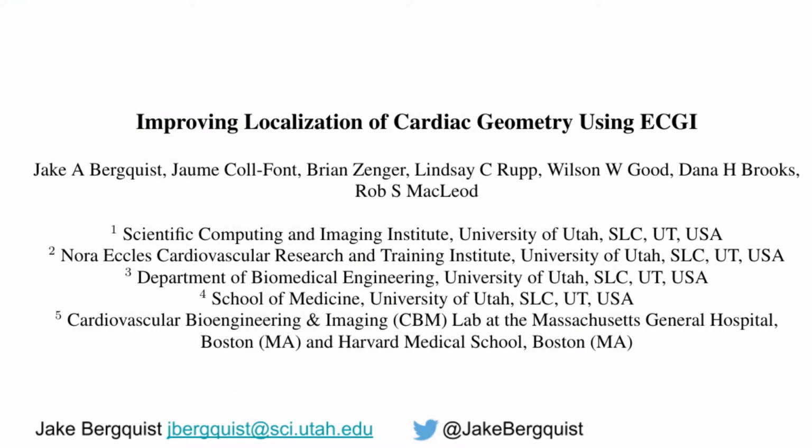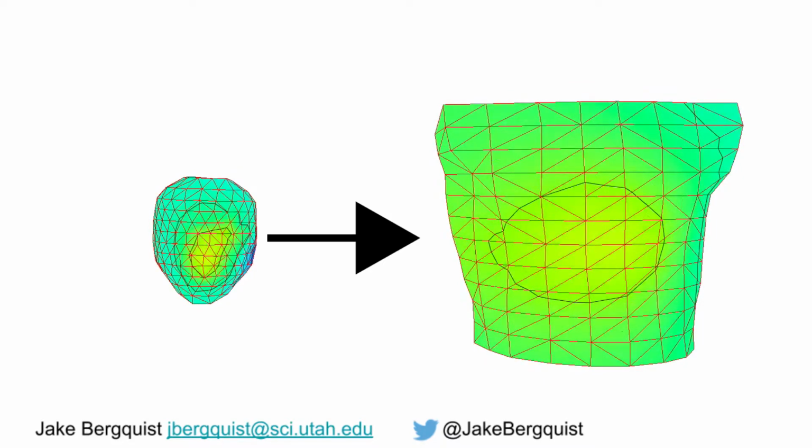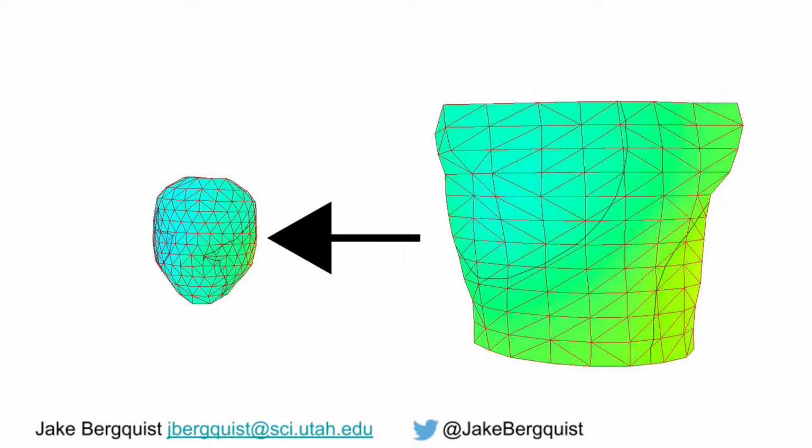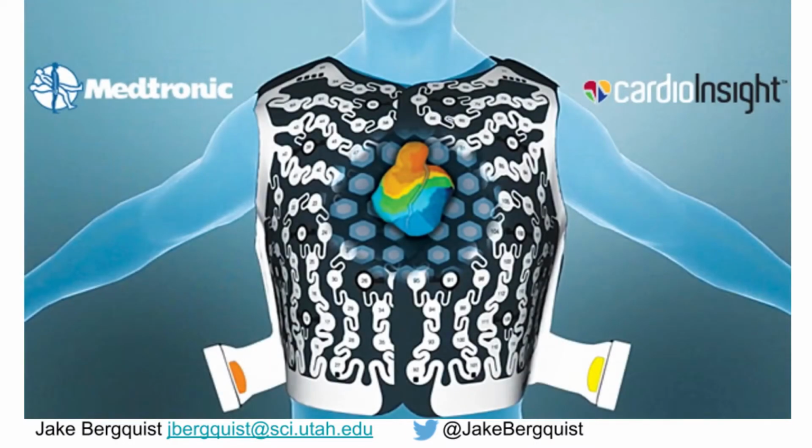Electrocardiographic imaging, or ECGI, is based around the principles of using the physical relationships between how an electric source from the heart propagates to the body surface, and then inverting this relationship in order to calculate the cardiac source potentials given a body surface recording. Several ECGI systems have emerged clinically and have been used to great effect to diagnose and treat various cardiac dysfunctions using this non-invasive diagnostic method.